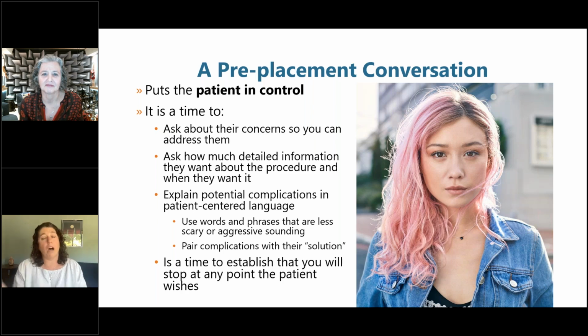And so that's one way that kind of language has been introduced to help the client know what they can do during the procedure to reestablish full control if they are having an experience that either needs to be paused or stopped. And clients may have their own language that they want to use. So check in with them, let them know, how do you want to communicate to me that you need to pause or a break? And what words do you want to use to communicate to me that you are fully done with the procedure and no longer want to continue with it?